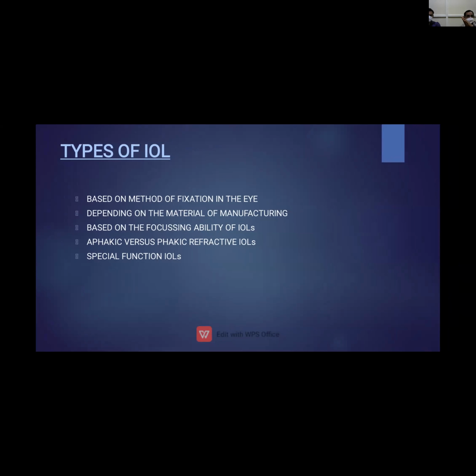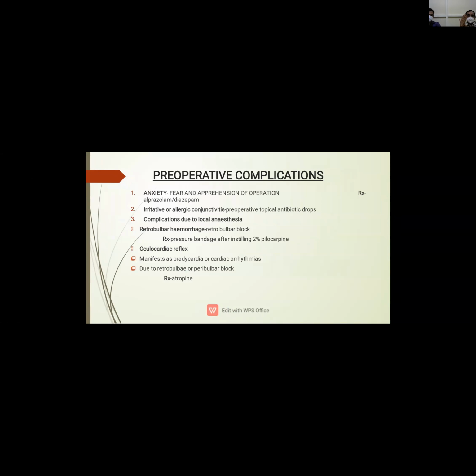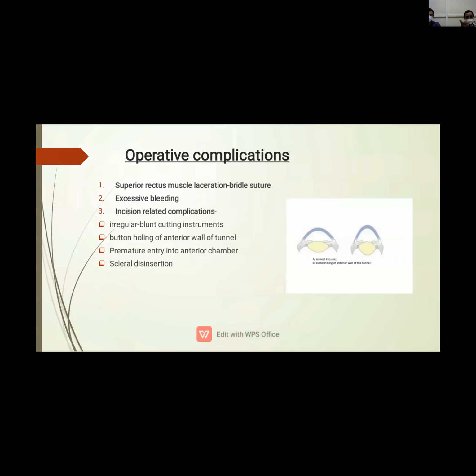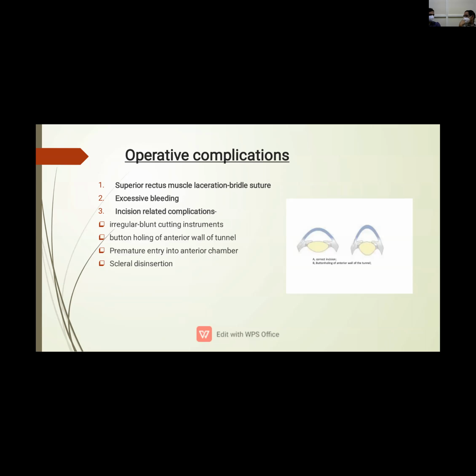Basically, we have preferred, as you mentioned, the complications for each technique separately. The preoperative complications are almost the same for everything. But the postoperative or perioperative complications differ for intracapsular cataract extraction, extracapsular cataract extraction, small incision cataract surgery, and also phacoemulsification. And the other lady, I think Navya, hasn't mentioned laser-assisted cataract surgery. Femtosecond laser, she has not mentioned it, and she should have mentioned it in her talk.